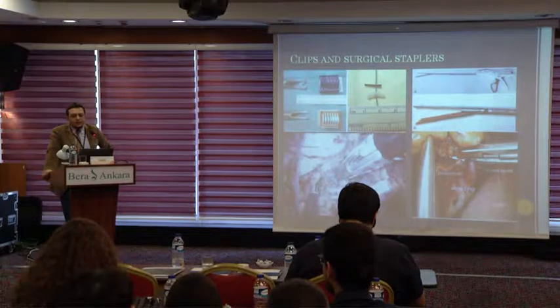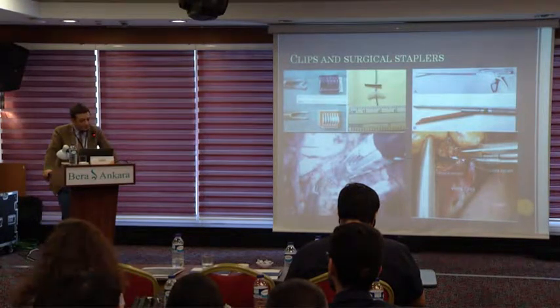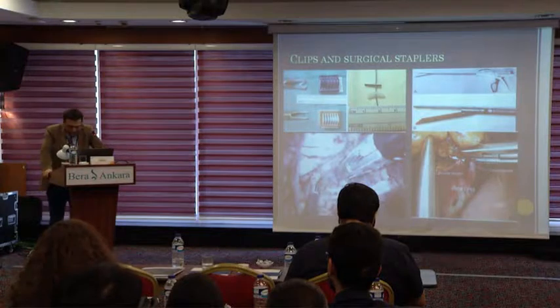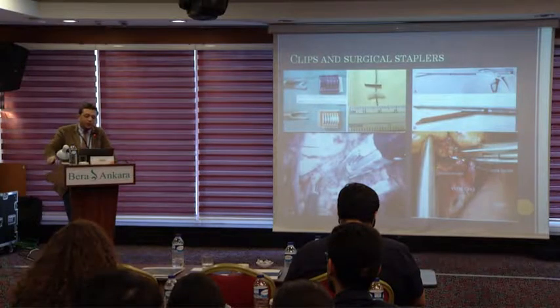The safety of the product has been proven before, but we must be very careful when using the Endo GIA.